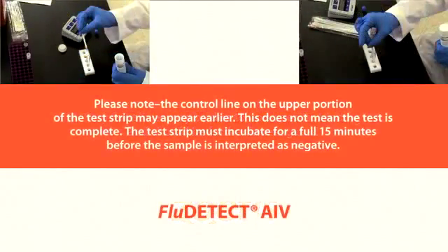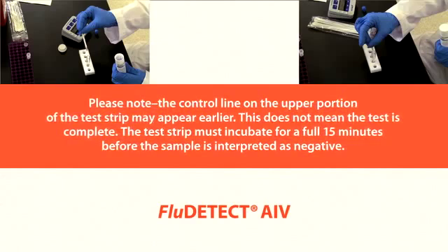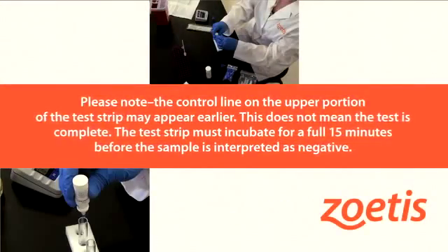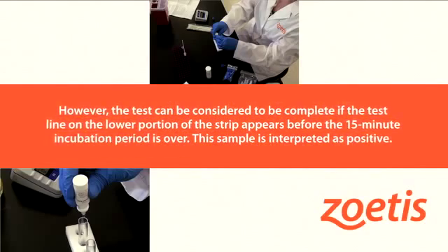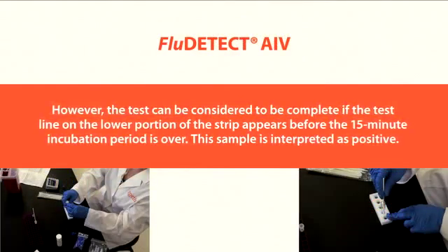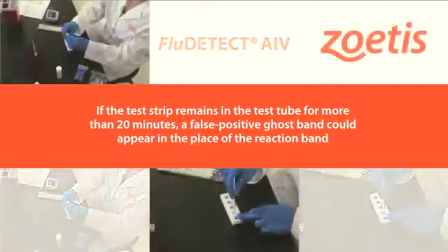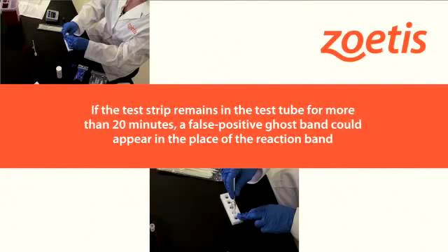Please note, the control line on the upper portion of the test strip may appear earlier. This does not mean the test is complete. The test strip must incubate for a full 15 minutes before the sample is interpreted as negative. However, the test can be considered to be complete if the test line on the lower portion of the strip appears before the 15-minute incubation period is over. This sample is interpreted as positive. If the test strip remains in the test tube for more than 20 minutes, a false positive ghost band could appear in the place of the reaction band.